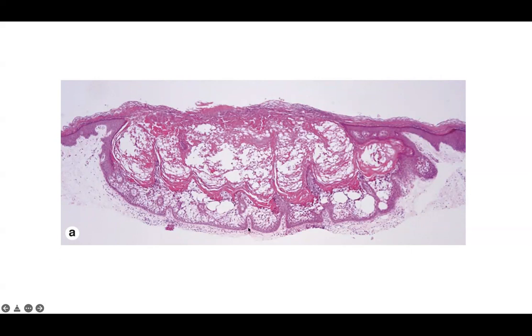Now, you often will see epidermolytic hyperkeratosis as an incidental finding in many different disease entities or skin specimens. So if you see it, it may just be an incidental finding that's not relating to the other pathology in the specimen. You could mention it as well.